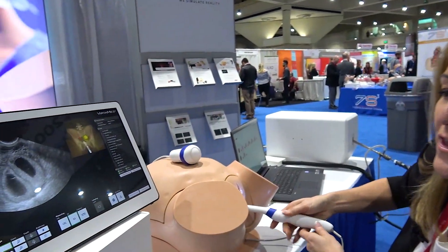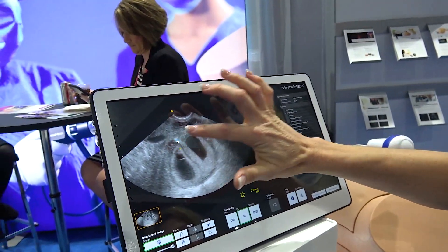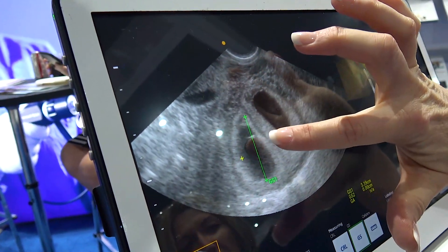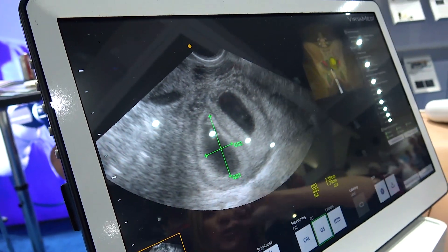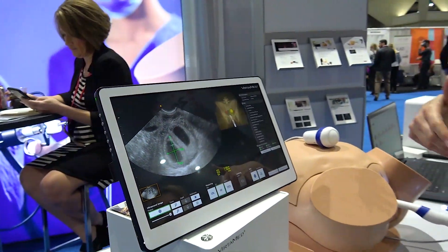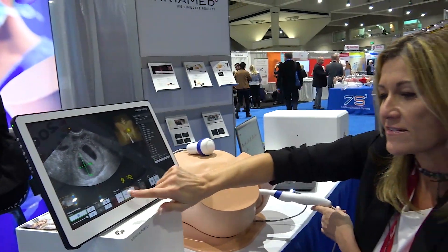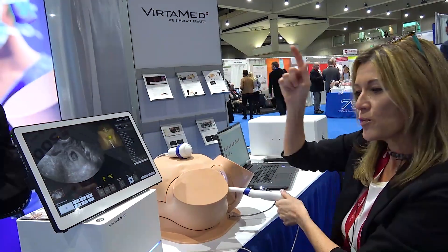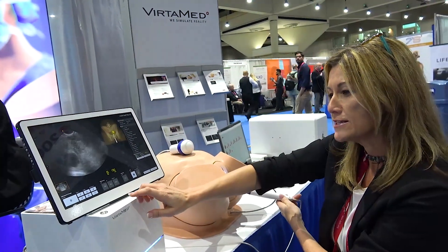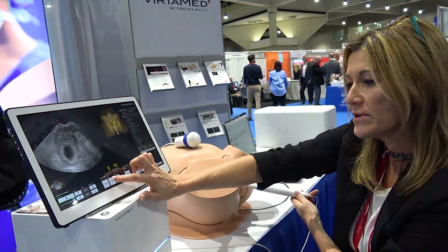Our simulator allows sonographers to practice in a risk-free environment. A lot of times sonographers don't have access to pregnant patients, and when they do, you want to respect the rules of ALARA by not exposing that baby over and over again to unnecessary ultrasound scans. So in this case we allow sonographers to practice their measurement and scanning skills in a risk-free environment.